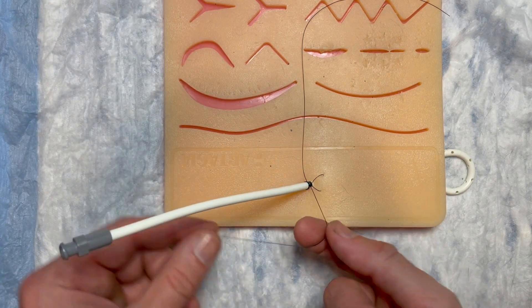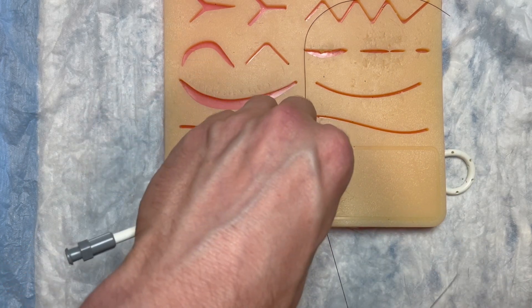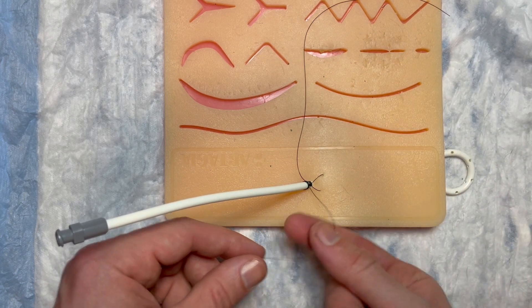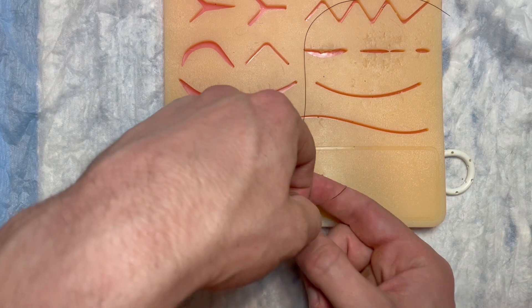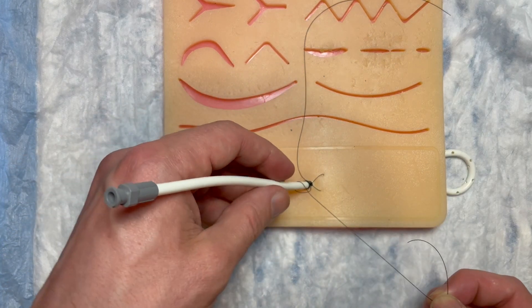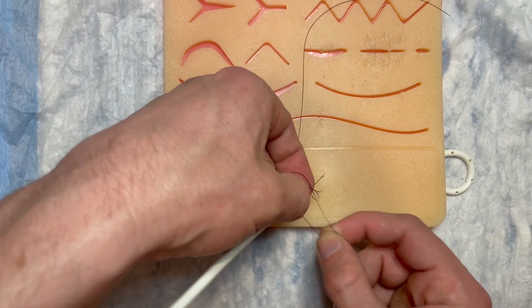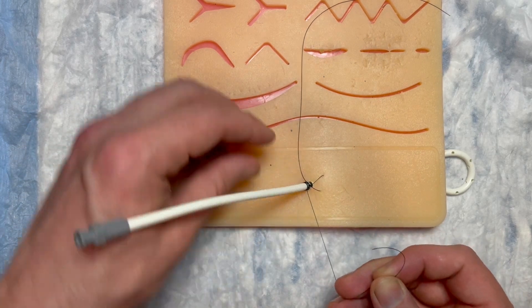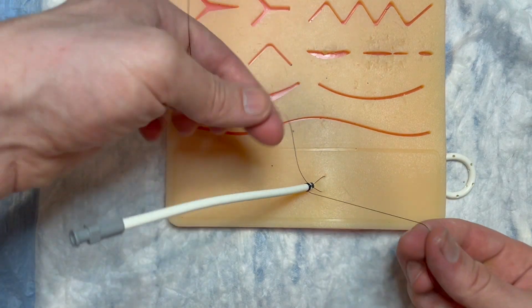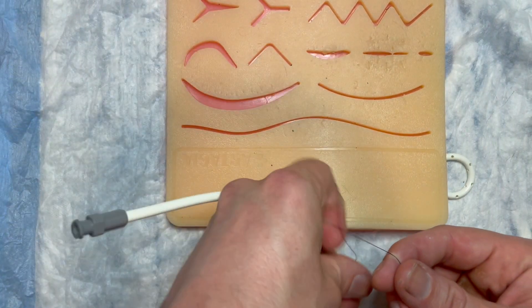And now it's the exact opposite on this side. So I just pulled from this side, on my right side now do one. I want to make sure these loops don't start stacking on top of each other, they're just laying in an orderly manner. There's another one and here's our final one here. Look how much more simple this configuration is and look how secure that is too. So now I can just tie this off like I would any other knot.